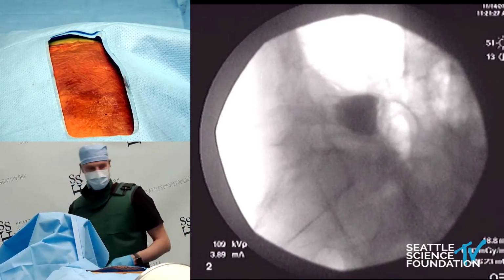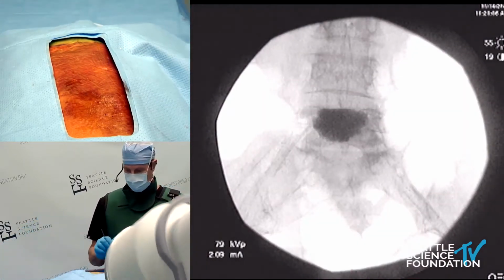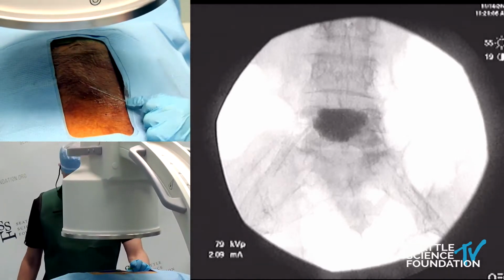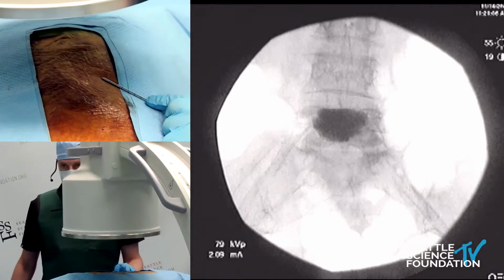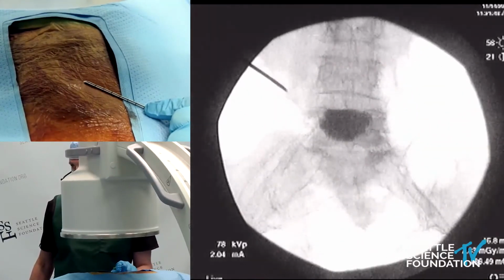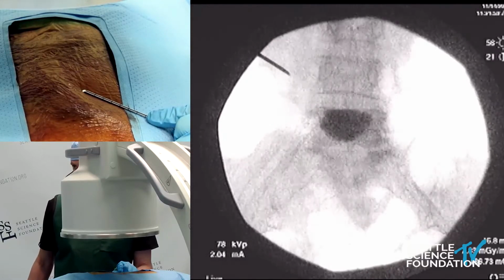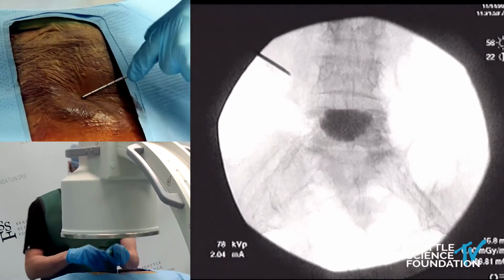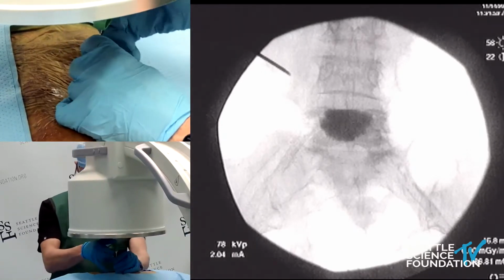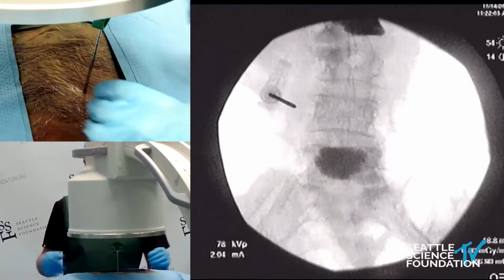All right, so one of the greatest advancements in vertebral augmentation recently has been the advent of the spine jack. This is the only device that has been shown to be statistically significantly better than the predicate in 36 years of vertebral augmentation. And we'll start at this level. This is L4 approach. Again, I'm using a beveled needle, the same needle system that's been sold by Stryker for a good number of years.